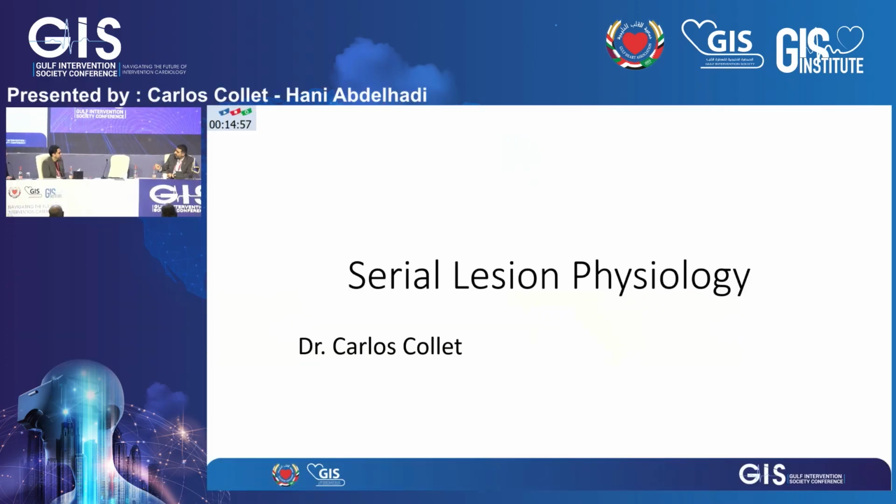And then you found some significant disease in the circ and the RCA, and now you are sending the patient for CABG. And the FFR is barely positive, something like 0.79. Now, are you confident to send this patient for CABG with a LIMA? Or would you say, you know what, I will just treat medically at that point and see what's going on?